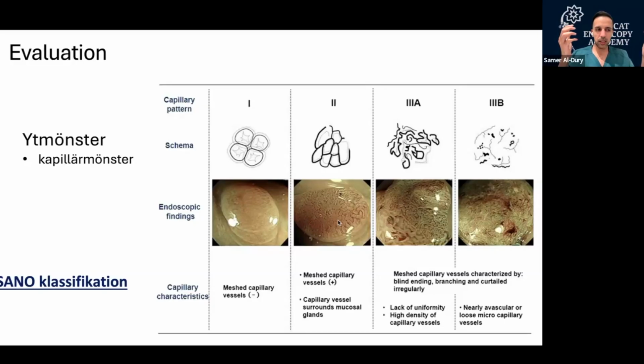I think this is something that can cause some confusion sometimes, because quite often a polyp is not homogeneously irregular. If it's cancerous, quite often there's a bunch of areas in it that look pretty regular, and there's that one little area that is irregular, or that has basically absent vessels or amorphous vessels, or is totally disturbed.